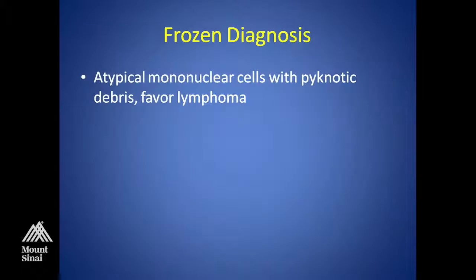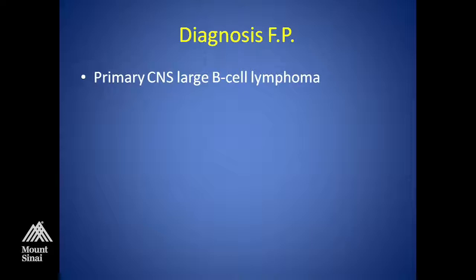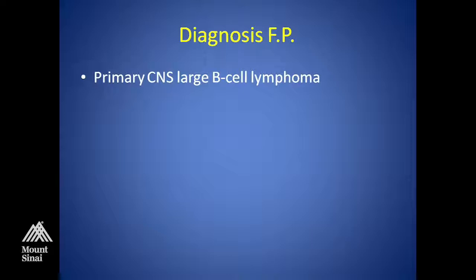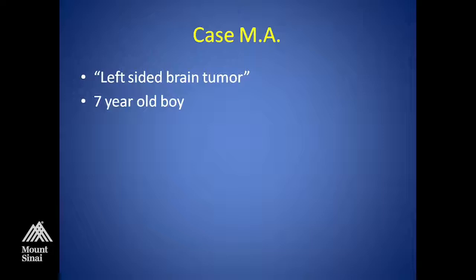On frozen, this was called atypical mononuclear cells with pyknotic debris, favor lymphoma. You've got to be careful because some high-grade gliomas can look similar. Here's the radiology, and this was a primary CNS large B-cell lymphoma. Next case: a 7-year-old boy with a left-sided brain tumor. I'm deliberately not showing the radiology so you can get an assessment of the cells without a clue from the imaging.